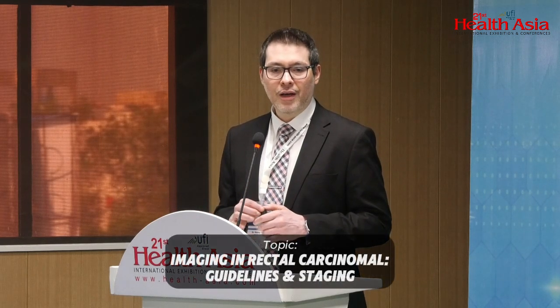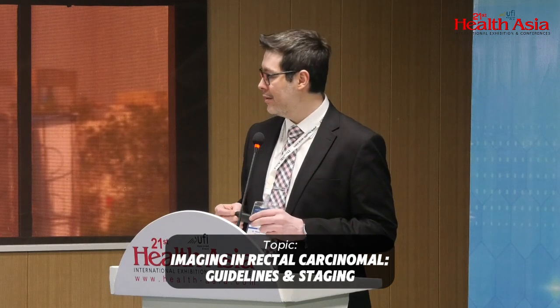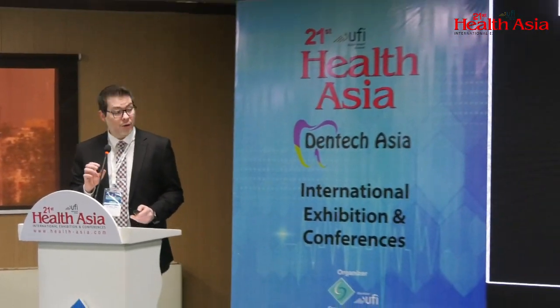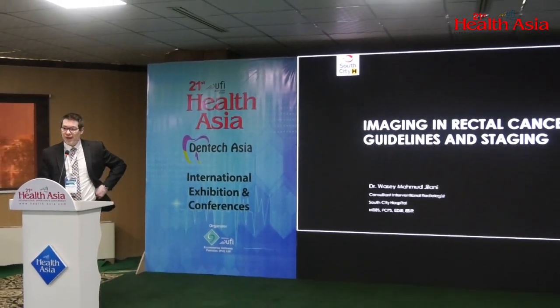So today's presentation will primarily be targeting the younger audience here. We'll try and run through basic staging, basic guidelines of rectal tumors. Nothing very elaborate. We'll take you from the basics and try and simplify how you can go about interpreting patients who have rectal cancer. Okay, so we'll be talking about imaging in rectal cancer, guidelines and staging.